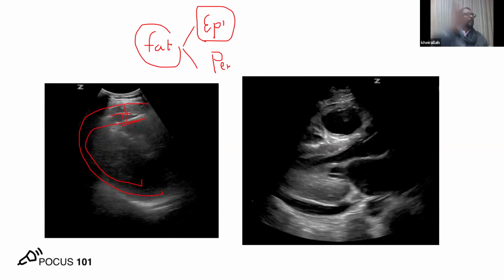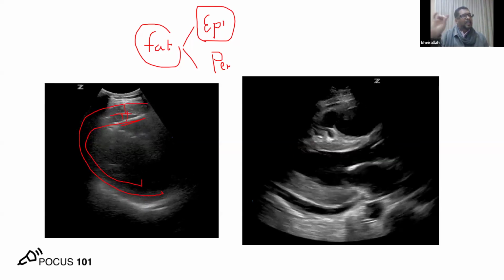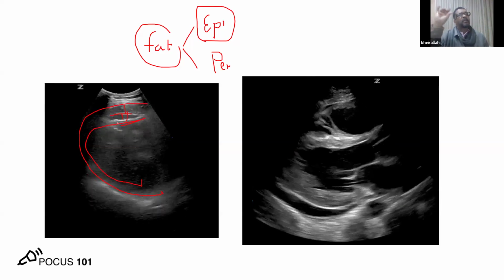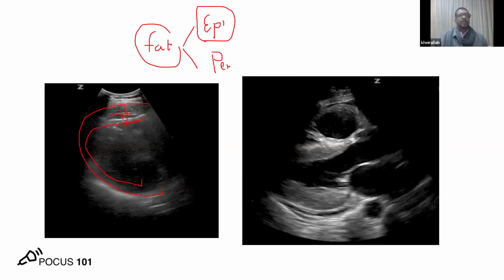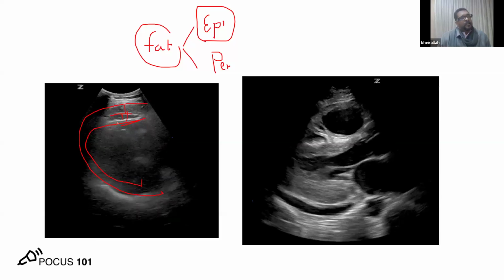The same applies to epicardial fat. ولذلك epicardial fat thickness is considered a non-conventional risk factor for coronary artery disease. If it is thick, it indicates that this patient is more prone to cardiovascular disease.